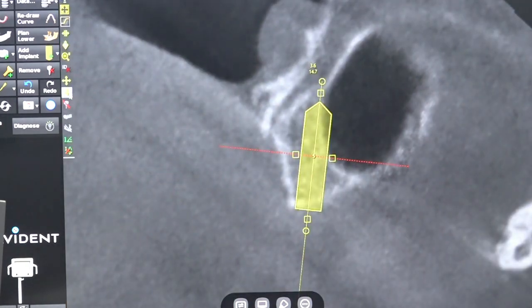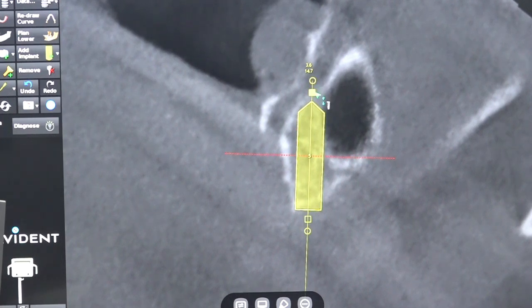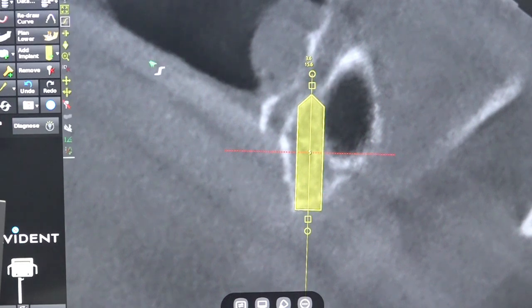So if you do the 360 degree, at one point of time you will see this descending palatine artery coming down, and it is exiting as greater palatine foramen. Sometimes this descending palatine artery is very close to our target area. Sometimes even it is difficult to avoid this structure. So some doctors plan to avoid this structure. That is one option, and sometimes it is not at all possible to avoid this structure. Sometimes you have to invade that, but that is not an issue.